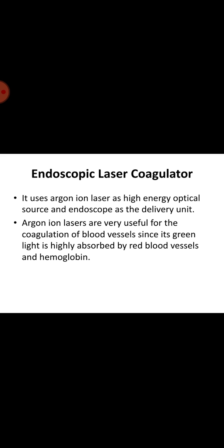With advances in quartz fiber technology, fiber optic delivery of an adequate dosage of visible or near IR radiation is possible. A gastric photocoagulator can be inserted into the biopsy channel of a conventional flexible endoscope for non-invasive control of gastric bleeding. The system employs a water-cooled argon laser capable of delivering more than 13 watts of continuous radiation when operating with all standard atomic lines.